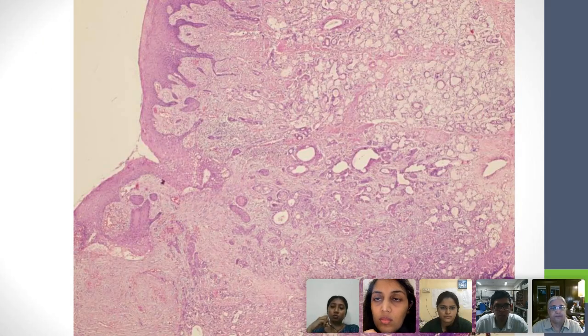Okay, Ashish, come on. On this power, I can see the normal squamous mucosa overlying it. On the right upper hand, there are normal salivary glands, minor salivary glands, and there is an ill-defined lesion in the subepithelial tissue. Okay. Forming glands. Anything else? Ill-defined lesion in the subepithelial tissue. Okay. Glandular lesion, that's what you're calling it. Why are you calling it glandular, Ashish?